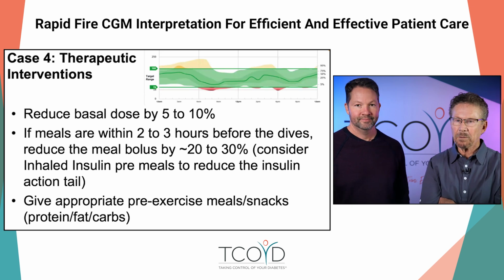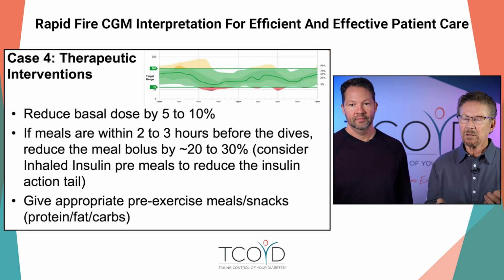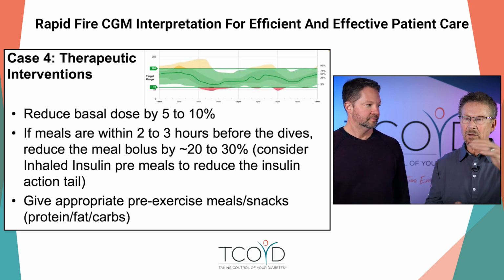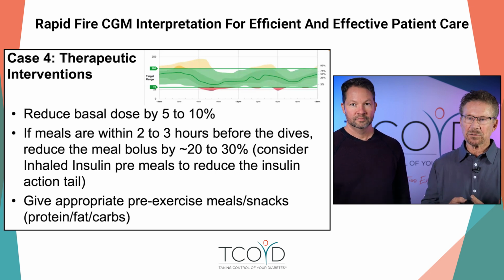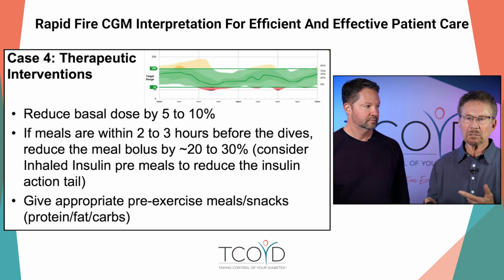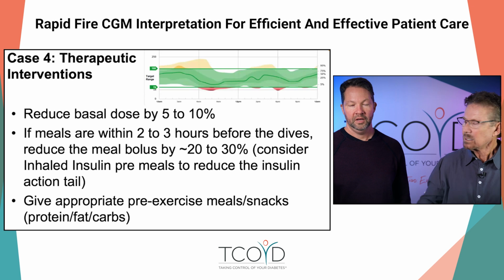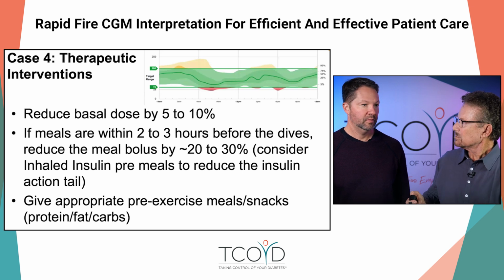Yeah, and if he was on a pump, of course you have to take it off. That's why he's not on a pump. But you're right. You'd rather be a little bit on the high side. And I don't think any exercise drops blood sugars more than swimming. And he has all the equipment. You swim? I can't swim.